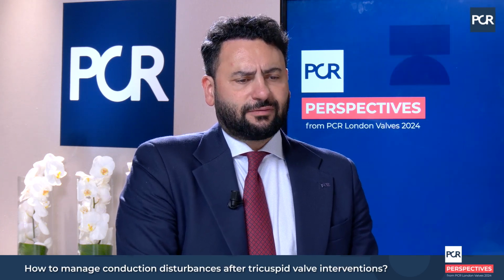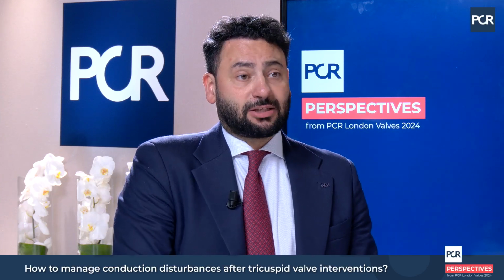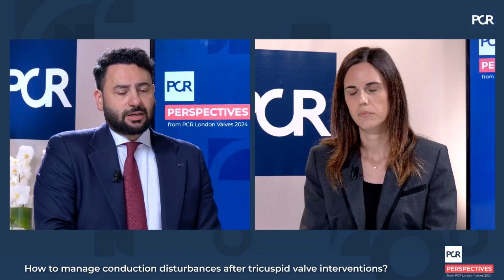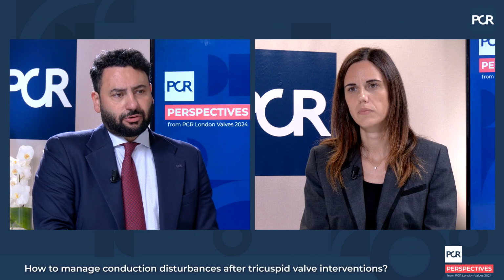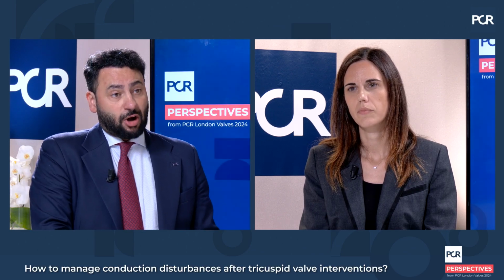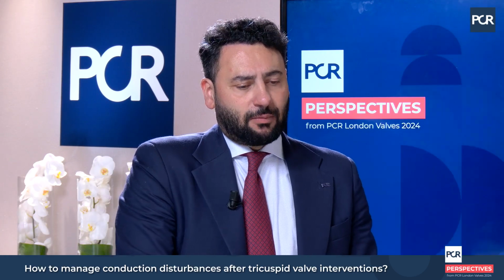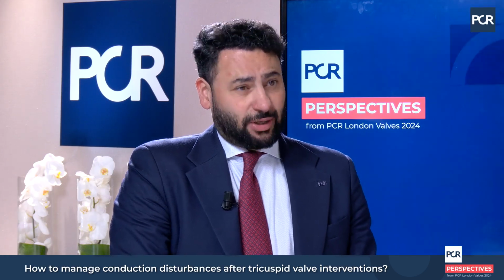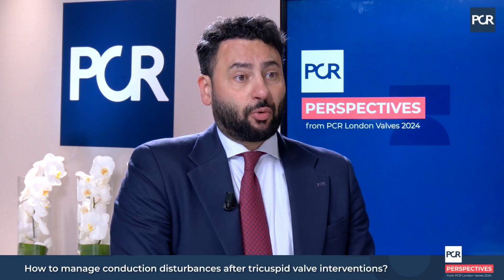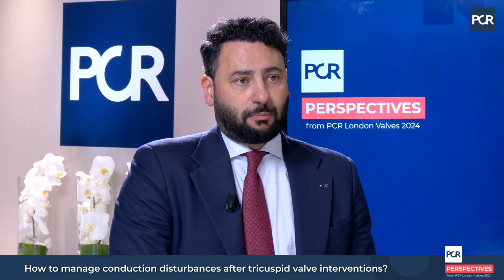First, I have to say, usually the AV block is preceded by some slowdown of the heart rate. So it's important, before the procedure and after, if you see some slowing down of the heart rate, to remove all the drugs that can impact the conduction in the AV node, withdraw beta blockers or digoxin. That's important. And in case we have a complete AV block during the procedure, which is really uncommon, you can pace through the wire that is usually in the apex and have some time to implant a pacemaker at that moment.